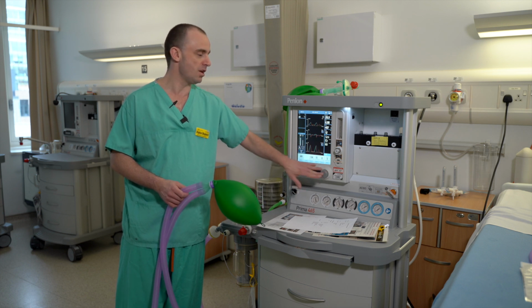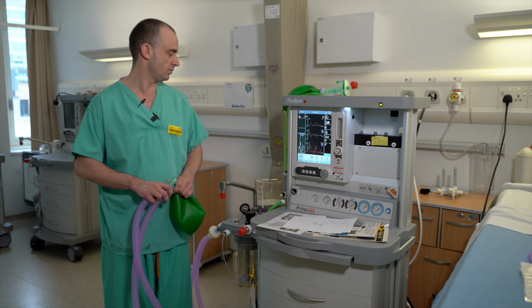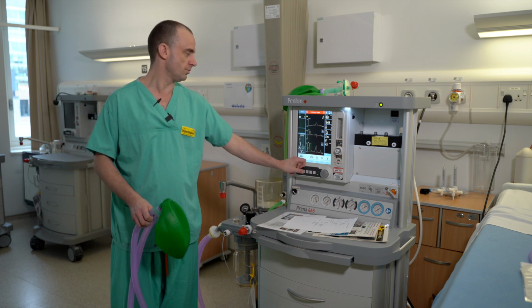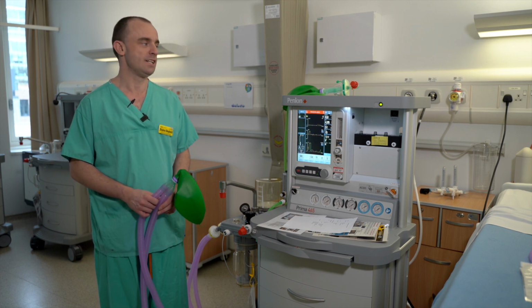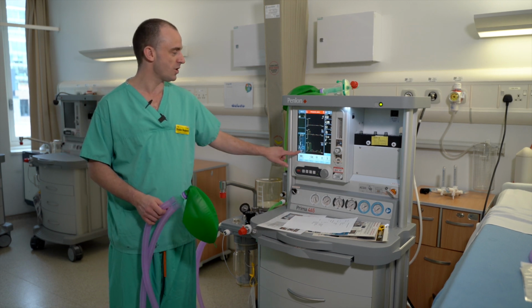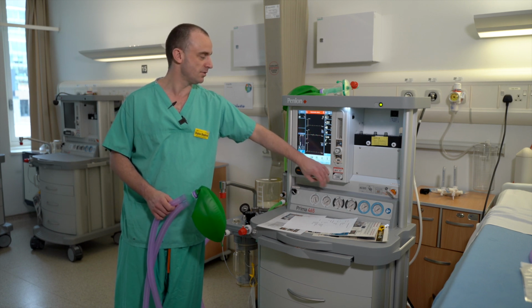Having increased the gas flow, what you'll see as well is if the minute volume is high and the total flow is low, the bellows will fall, but it will take time for this to fill. As I say, you can increase the total gas flow to fill the circuit again, but this takes 4 or 5 breaths.